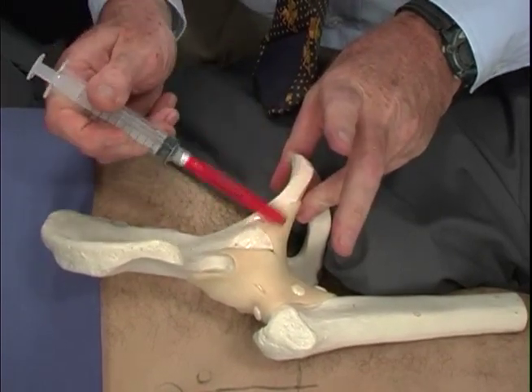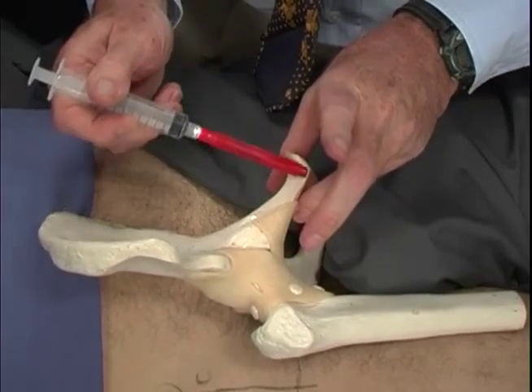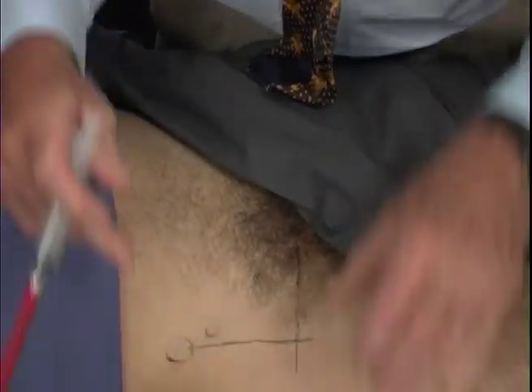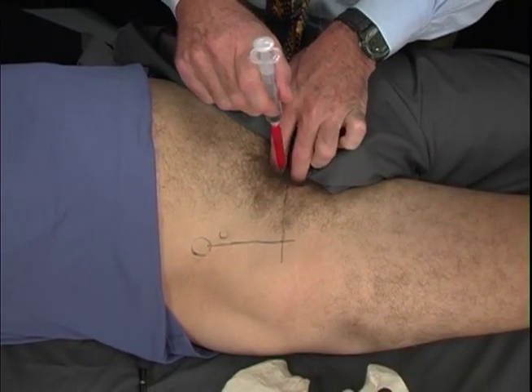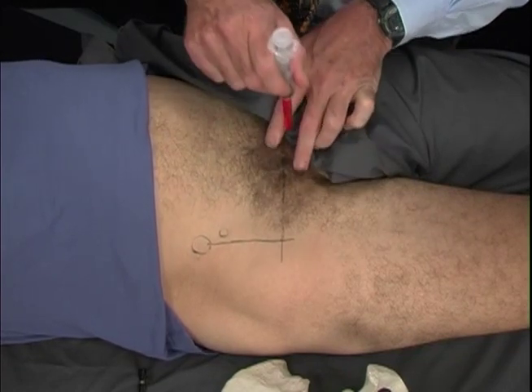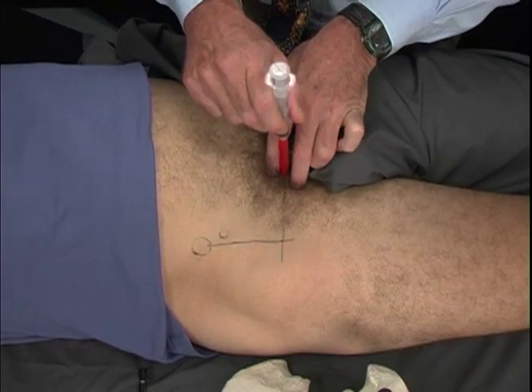And again, the adductors and these ligaments kind of combine to form this tissue along the ramus here. So we walk across as far as we can feel, and I can still feel ramus right there, coming down into that area, and just injecting small amounts of solution all across the pubic symphysis.